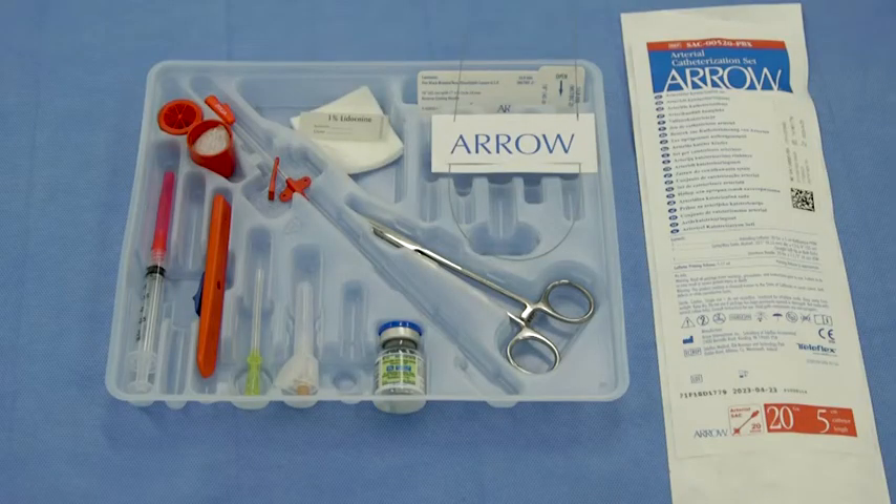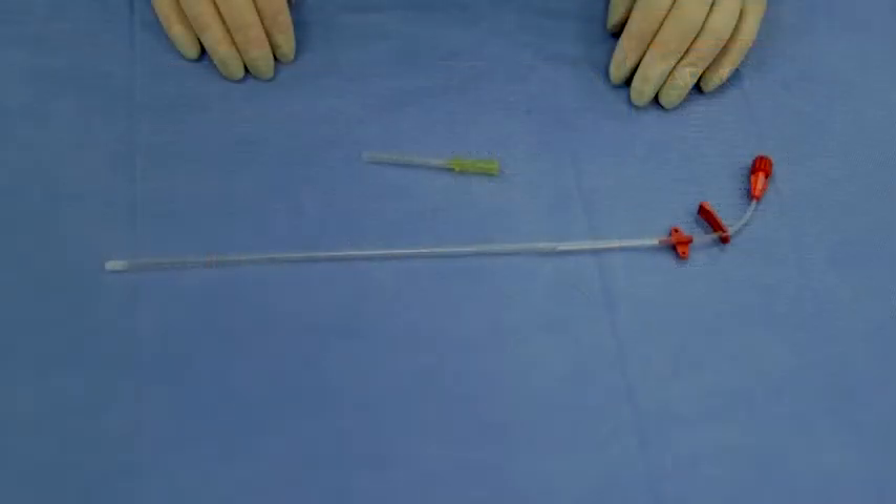This video demonstrates the insertion of the Arrow-Seldinger arterial catheter using the standard Seldinger insertion technique with ultrasound guidance. The Arrow-Seldinger arterial catheter from Teleflex is designed to improve patient safety by eliminating confusion of catheter identification, reducing complications associated with insertion technique, and providing optimal performance leading to effective treatment for patients.